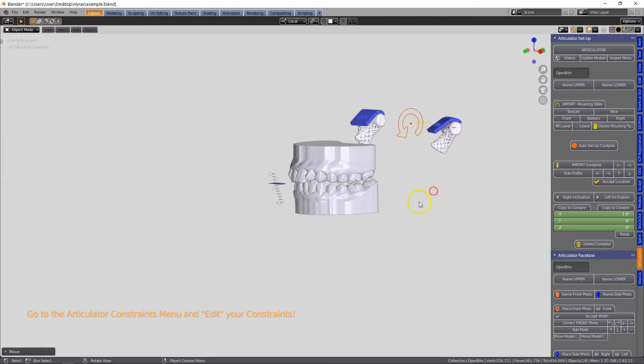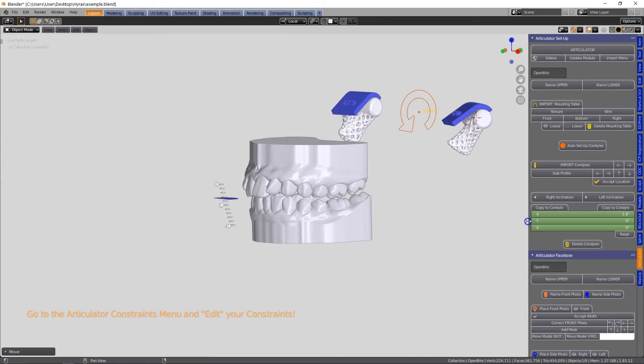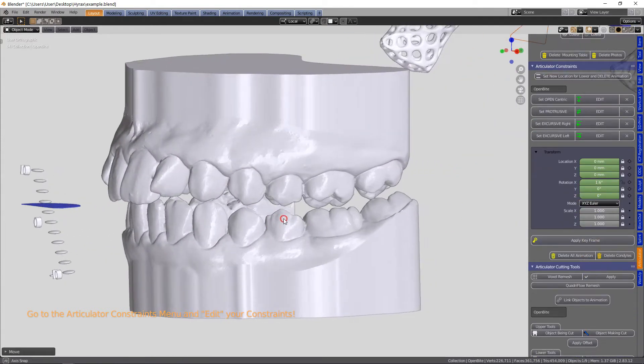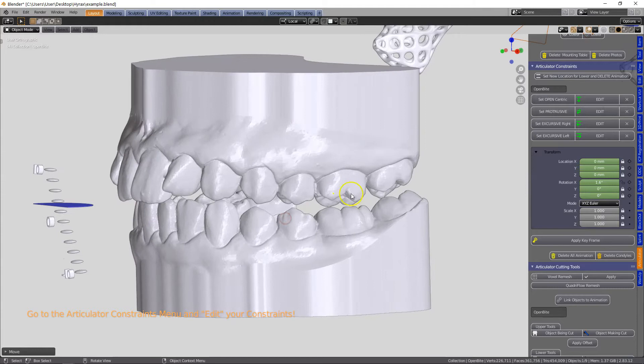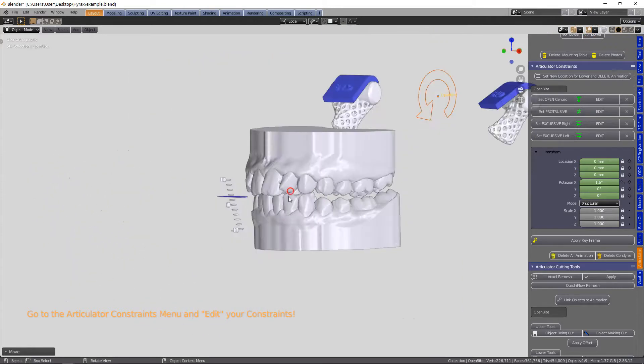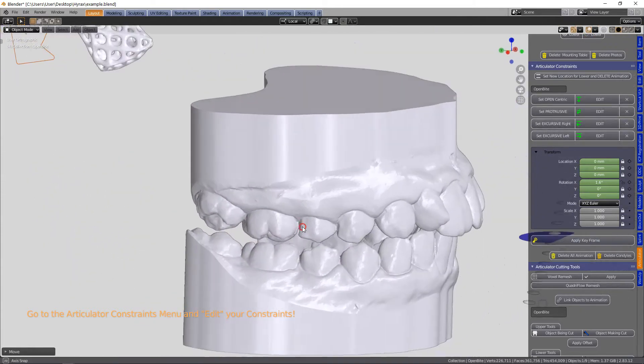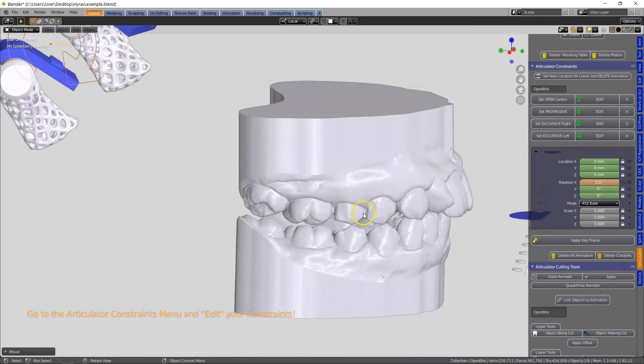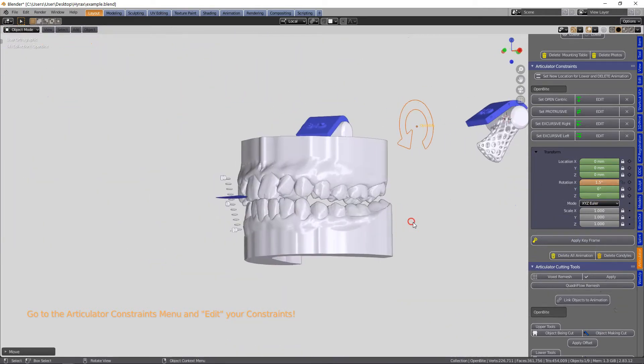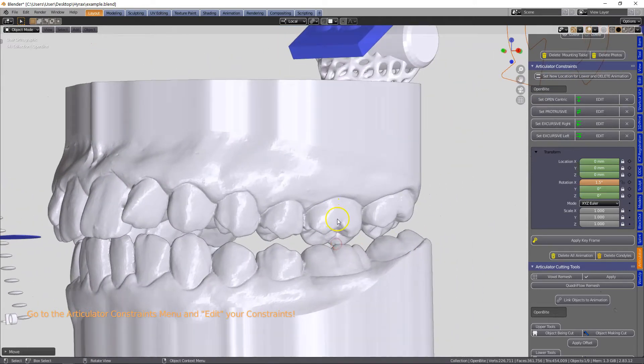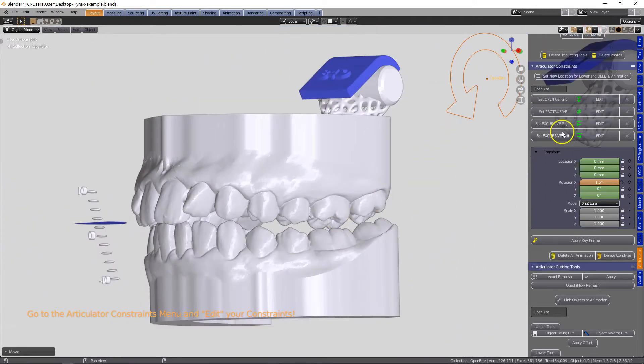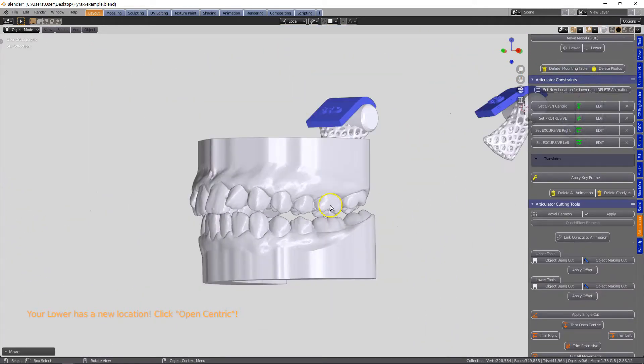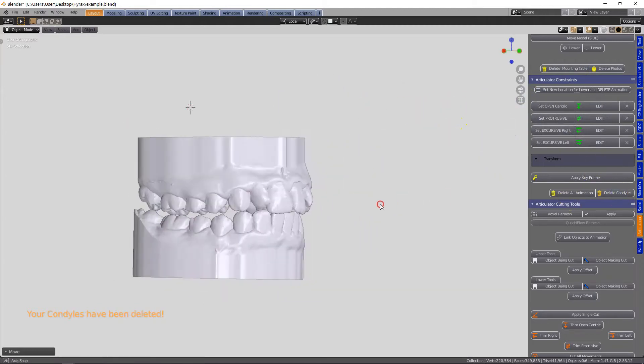Then we're going to bring in the condyles and then we're going to open the occlusion permanently a little bit. At the moment they're 1.6 degrees apart or 3.2 millimeters on articulator. Let's set this to 1.5 - later on in the video we'll discover that we should have maybe opened it up a little bit more.